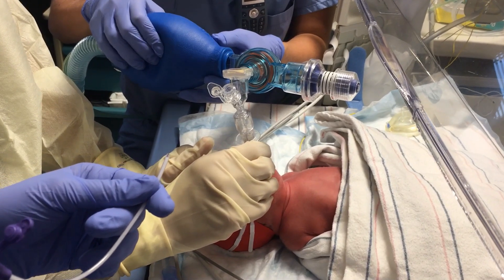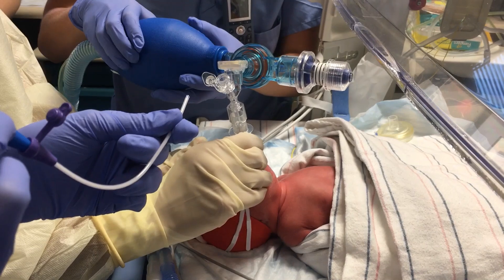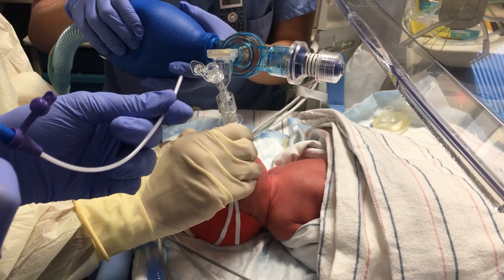Hi, Chris. She's got a little brady, but I think she's coming back up now. 115. Okay, you're good.